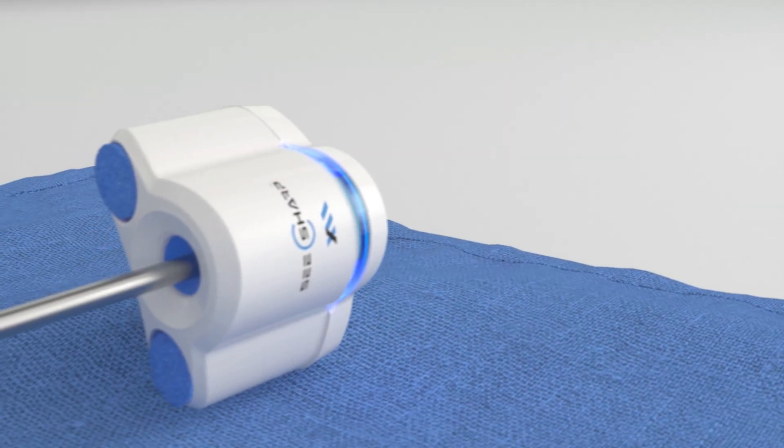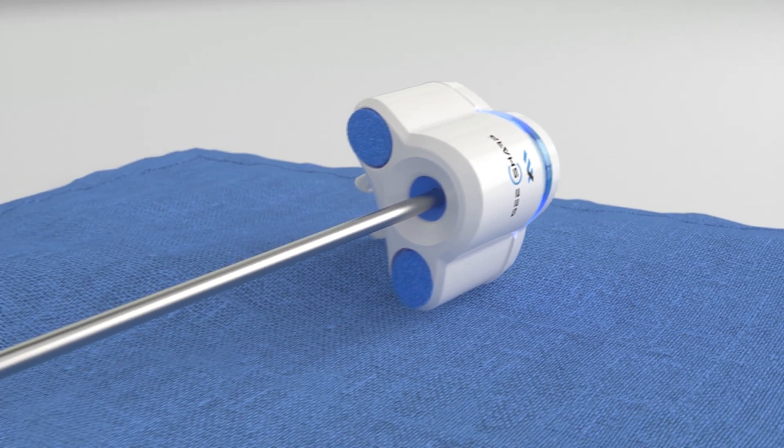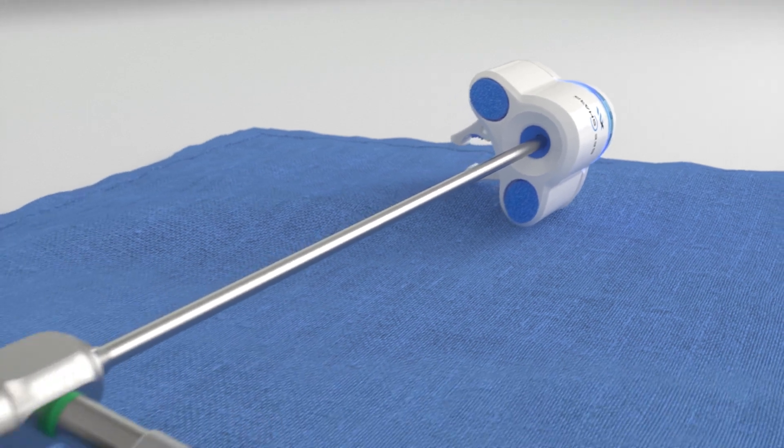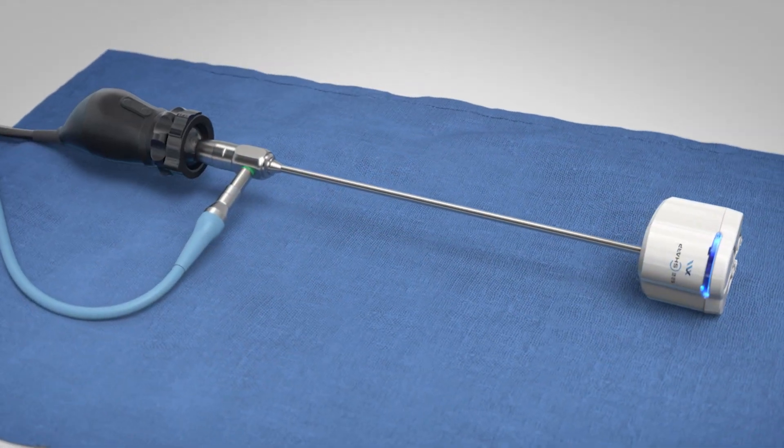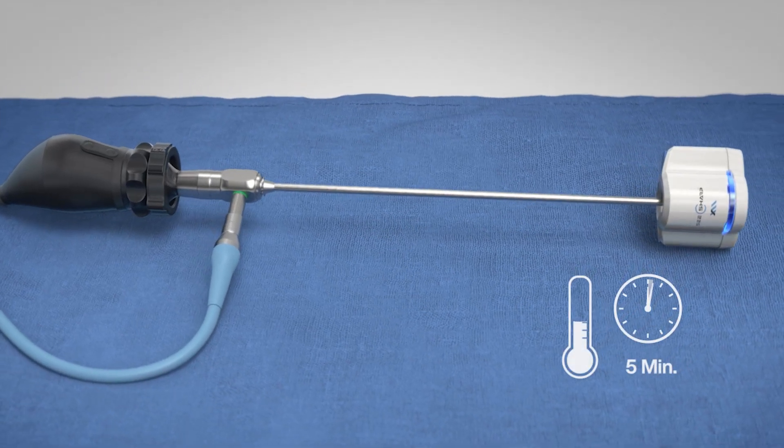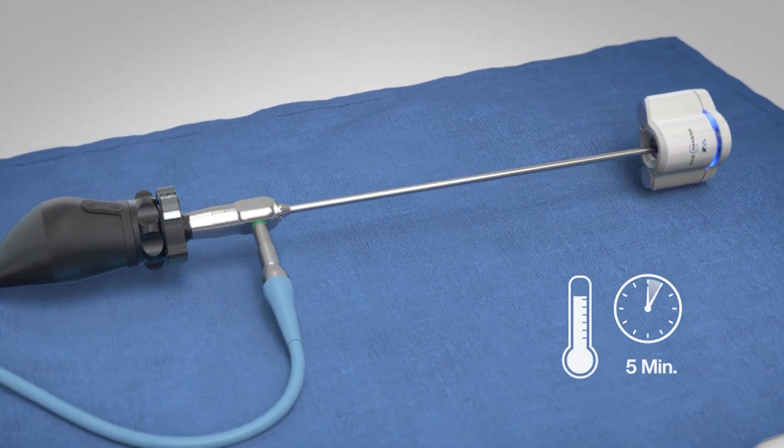Once the C-Sharp is at operating temperature, begin warming the laparoscope by fully inserting the lens into the reservoir. Note that the C-Sharp may be placed on its side to facilitate scope warming. Please allow five minutes to complete this stage.